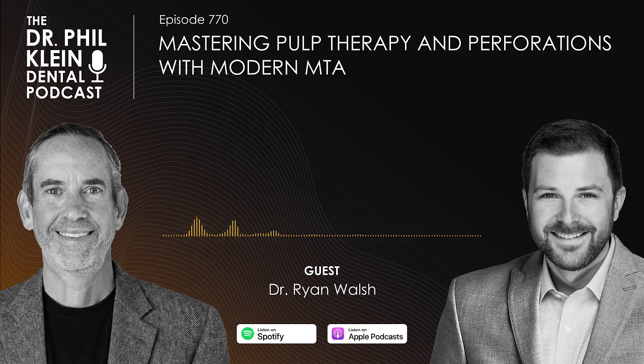The MTA VPT comes with a nice dropper that kind of tells you how many drops to scoops, and that creates a really consistent mixture. And I found that to be pretty advantageous. Right. So then you use kind of like a plugger and a hand instrument, and just kind of pack it in there.